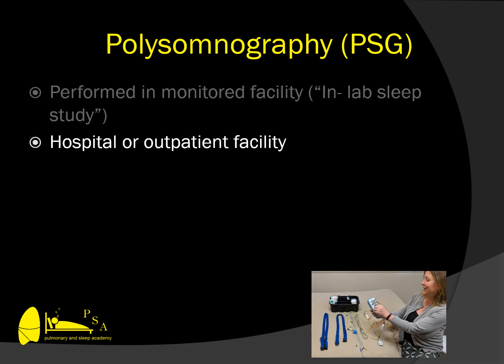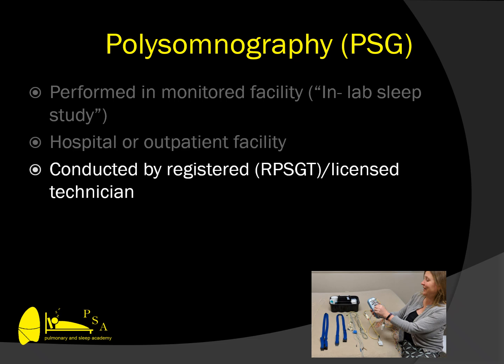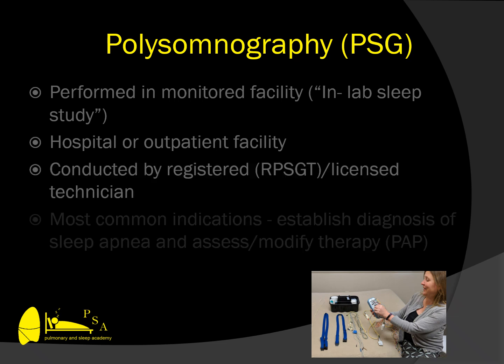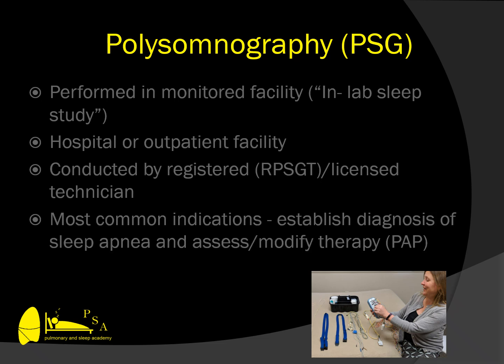It can be done in a hospital or an outpatient facility. It's always conducted by a registered technologist, and in most states, licensure is required for that technologist. Most common indications are to establish the diagnosis of sleep apnea and assess or modify positive airway pressure therapy.